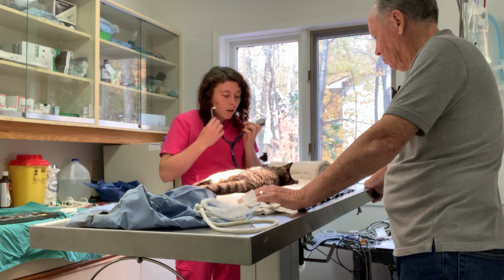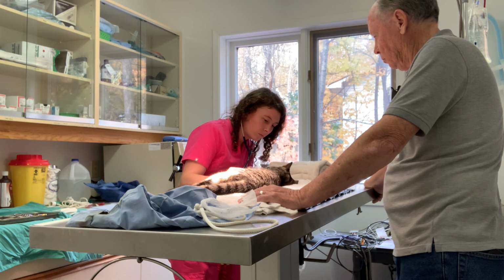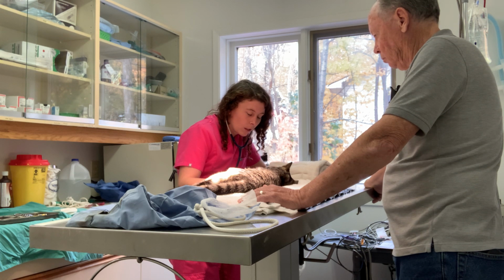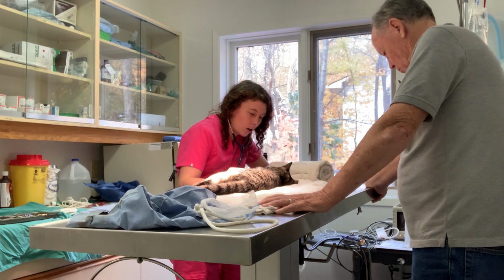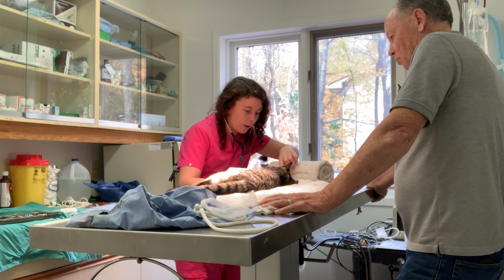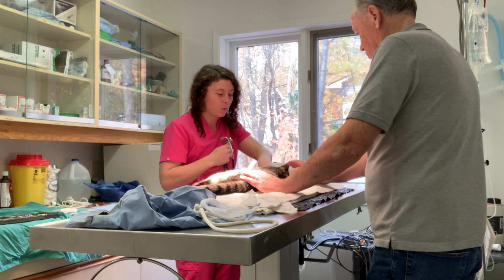You need to continue monitoring your patient as well. As great as it is to have a Cardell, the best way to monitor a patient is by physically listening to the heart rate, the respiratory rate, and checking the reflexes, making sure that the patient is in the correct stage of anesthetic. So your ears and your eyes are always the best way to monitor. We've got the cat waking up here now, we've got the swallow reflex, we're going to come out.